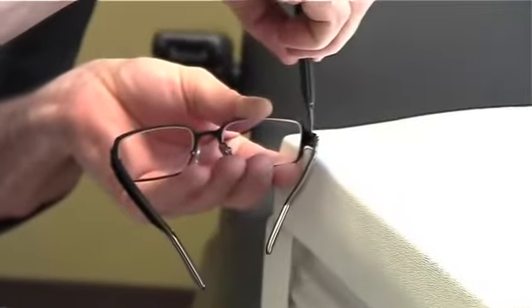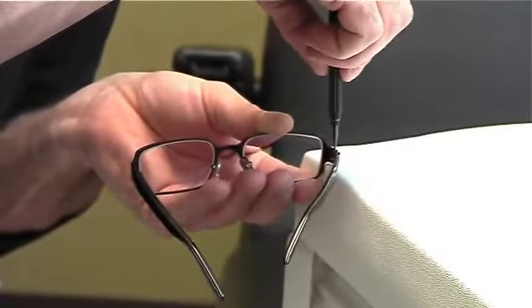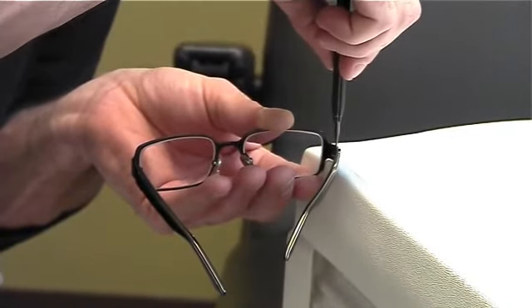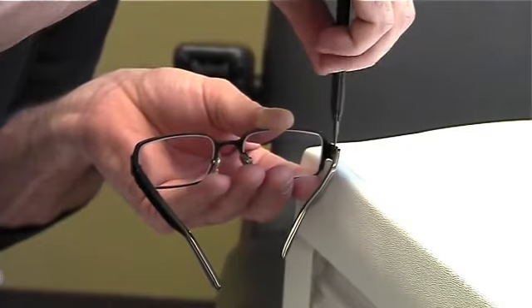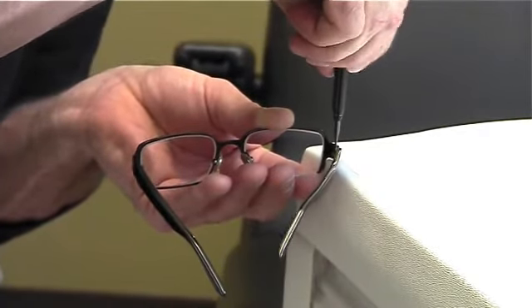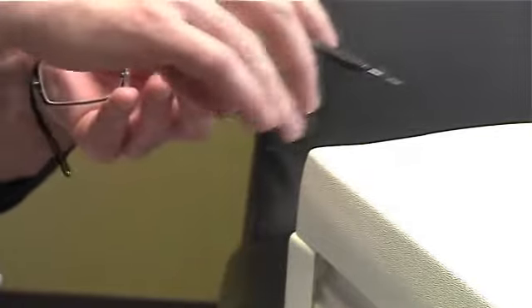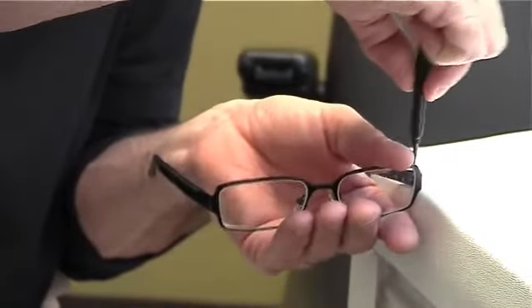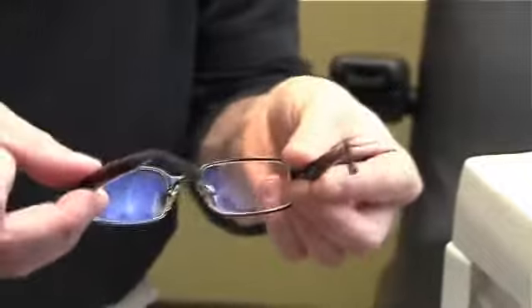So I'm going to begin by lining up the flat tip into the screw head, and then we're going to turn it clockwise to tighten and counterclockwise to loosen. But in this case, we're going clockwise, and so we've made the adjustment. It's now tighter. And of course, we can do the other side the same way. And now, I've got both of these tightened.